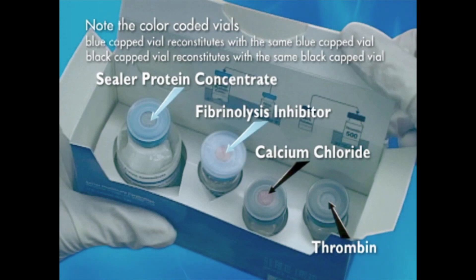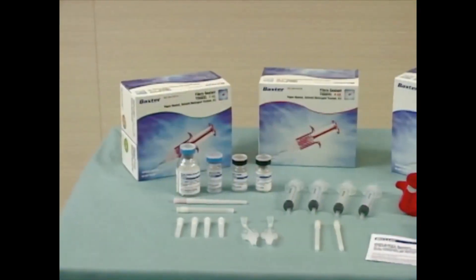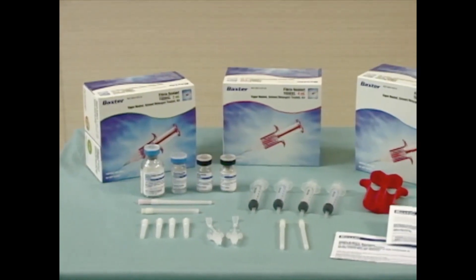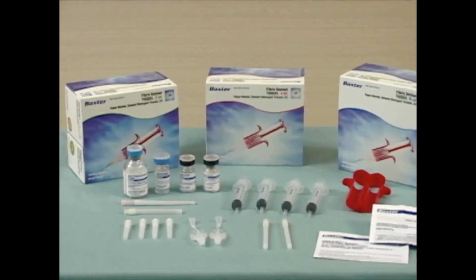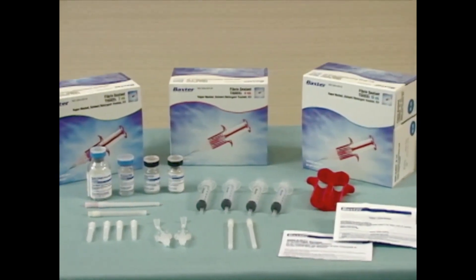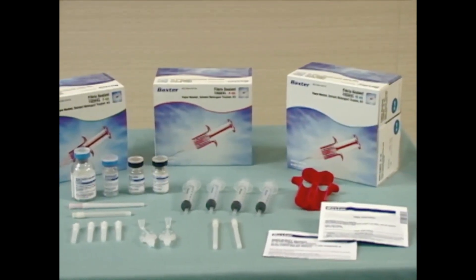When prepared properly, these components will create two reconstituted solutions: a sealer protein solution and a thrombin solution. The kit also contains the Duploject syringe applicator, two Y-shaped joining pieces, four applicator cannulas, four syringes, four needles, and the Tisseal Fibrin Sealant package insert.